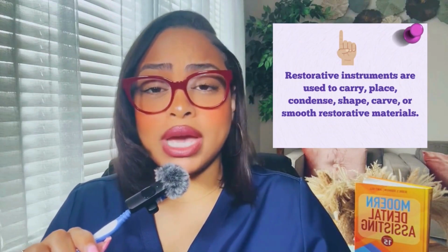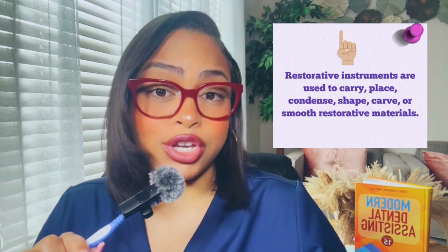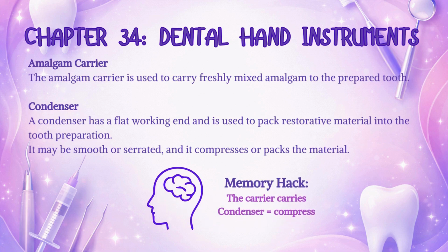Restorative instruments are used to carry, place, condense, shape, carve, or smooth restorative materials. Starting with the amalgam carrier, which is used to carry freshly mixed amalgam to the prepared tooth. Then the condenser, which has a flat working end and is used to pack restorative material into the tooth preparation. It may be smooth or serrated, and it compresses or packs the material.